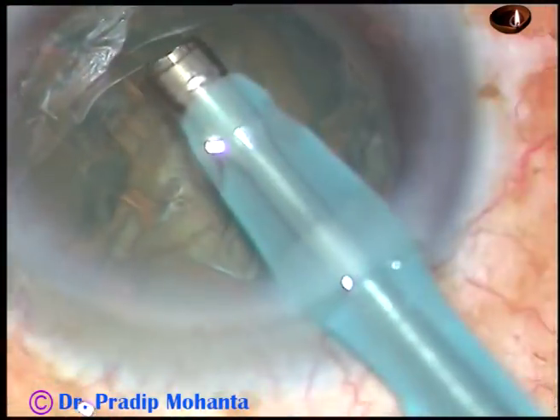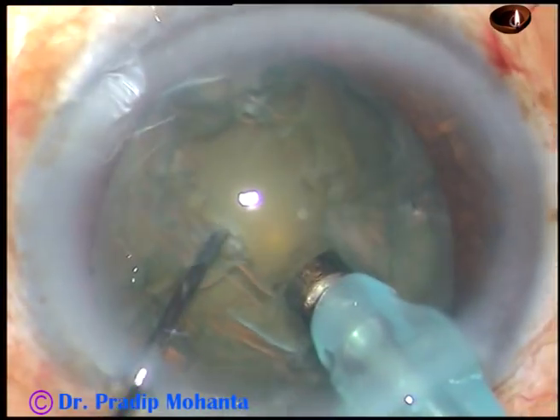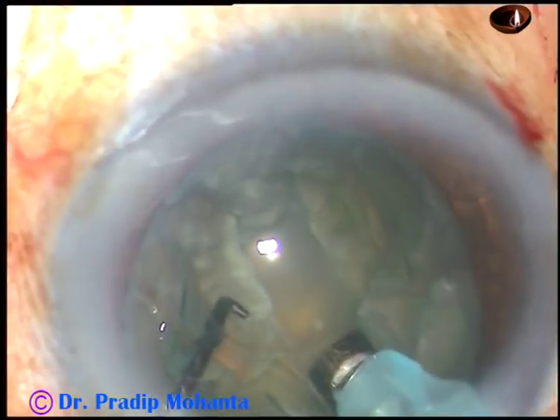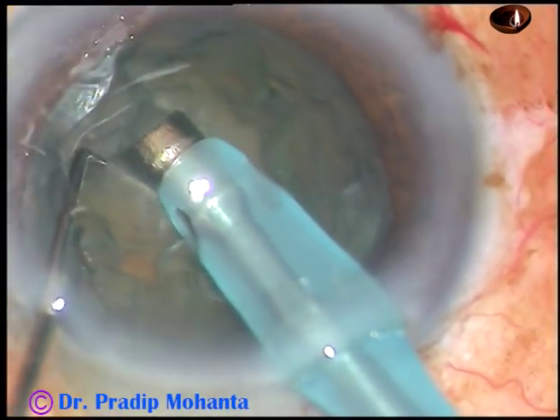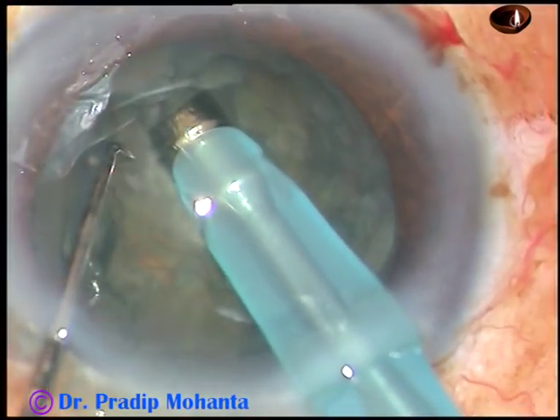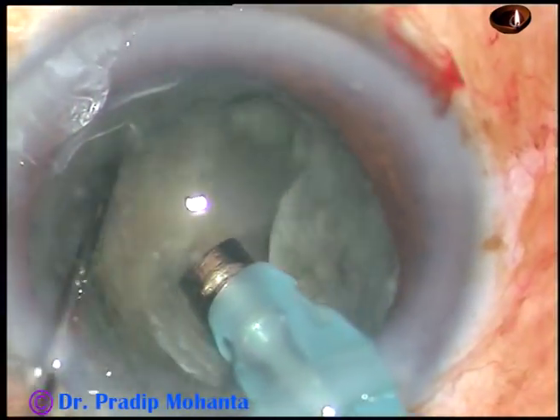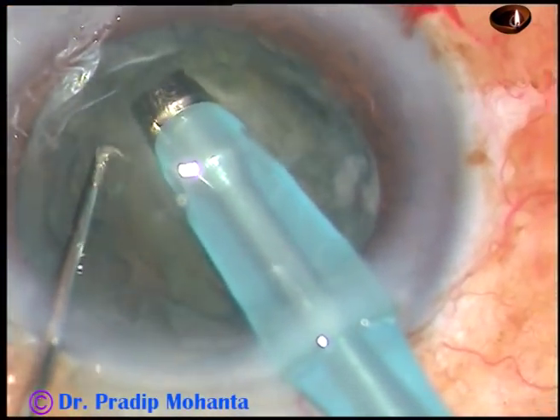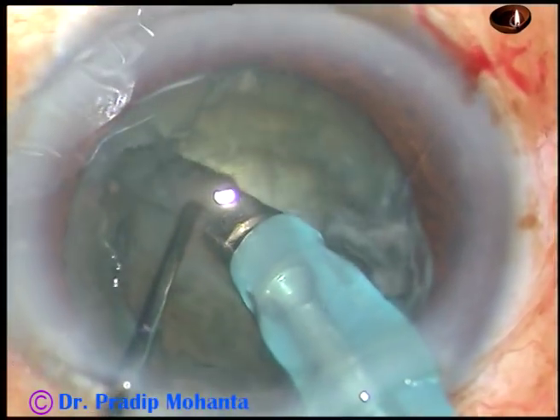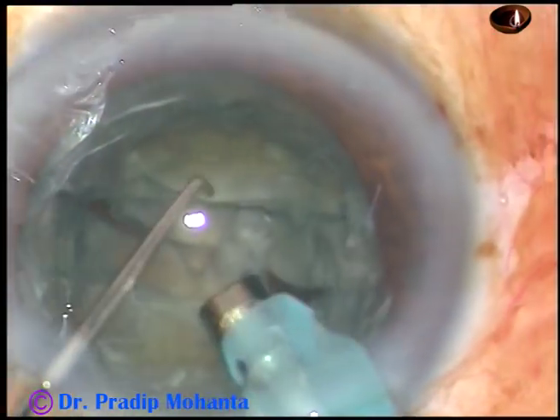In this case, I am going to do the stop and chop technique, where you just make one trench, divide the nucleus into two halves, and then chop each half. This is the first, second, and third application of energy. Go deep at the central part — you need not go deep at the peripheral part. Go deep at the central part, rotate 180 degrees, and extend the trench. And now keep opposite forces and you will see that the nucleus divides into two halves.